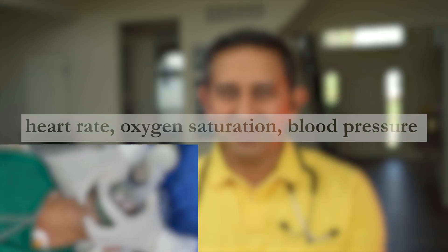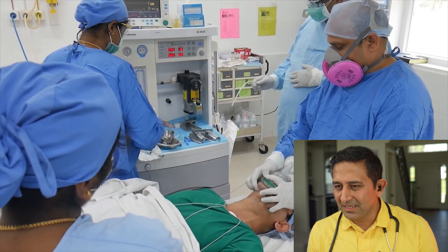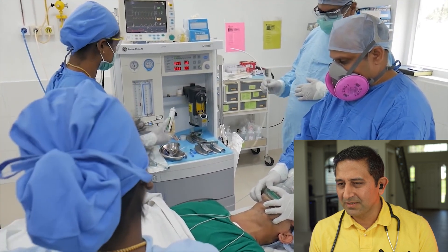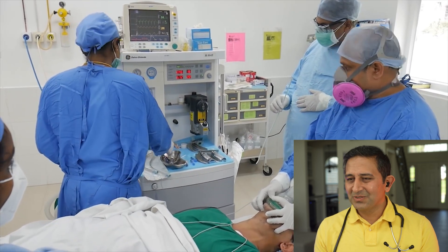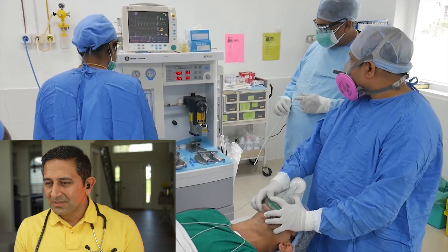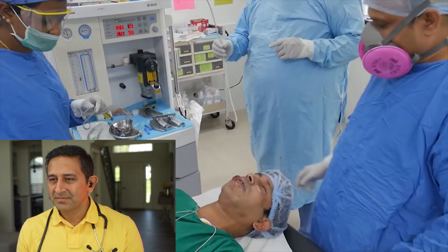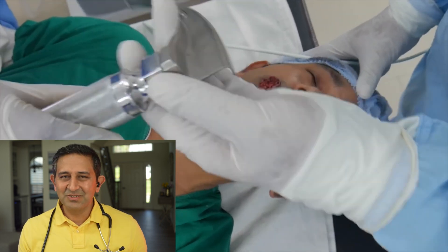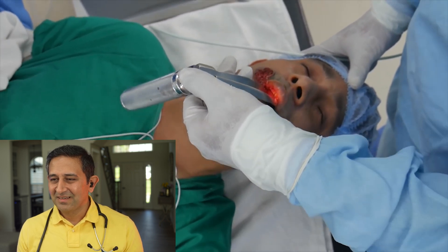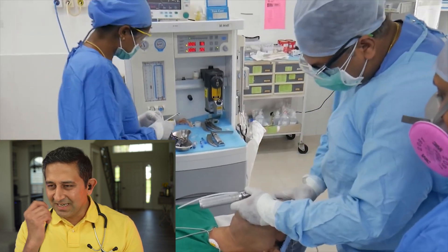As the patient is getting deeper with anesthesia, they are watching the monitor and making sure everything is stable in terms of heart rate, oxygen saturation, and blood pressure. The doctor is indicating to put some lubrication on the breathing tube so it goes in easily. The white thing the doctor has in his hand is called a stylet. That instrument is called a laryngoscope and after the laryngoscope is passed he may pass the stylet in.